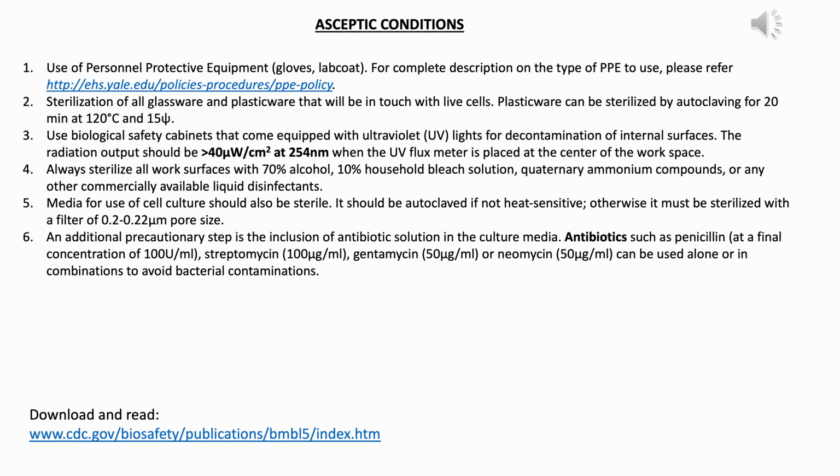Sterilization of all work surfaces one has to do with 70% ethanol. One can also use 10% bleach, or one can use quaternary ammonium compounds. These quaternary ammonium compounds, which were first introduced in 1917, are very good cationic surface active agents. These are generally used in 0.05 to 0.2% concentration, and these are active across a large pH range, from pH 3 to pH 10.